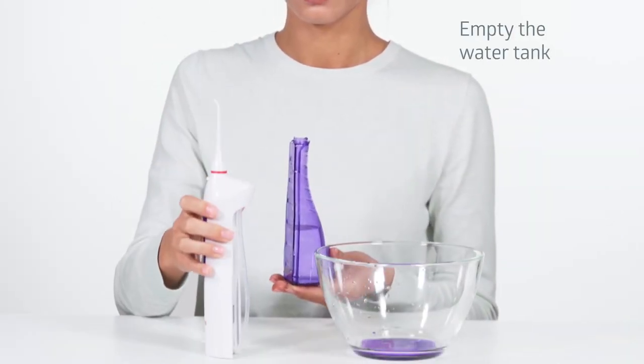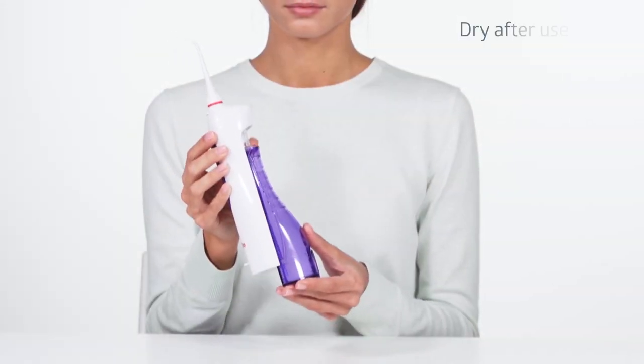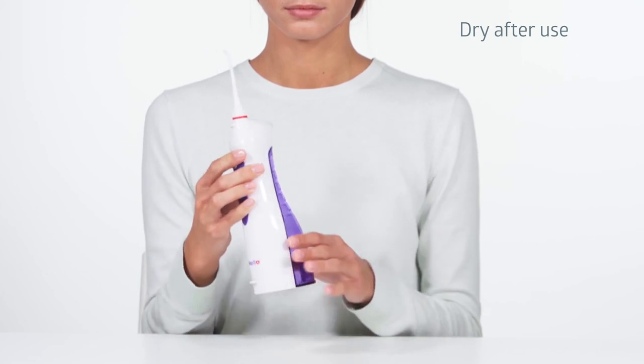Following the procedure, always empty the water tank to avoid generation of bacteria. You can dry the device by turning it on without water for two to three seconds.